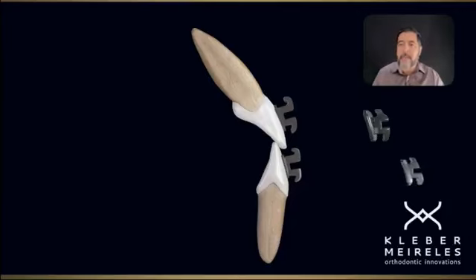brackets here. The brackets, the compensatory brackets, the class 2 or class 3 brackets, they are thought in two ways. They can be for finishing or for moving teeth in a compensatory way. Let's think about the finishing bracket, meaning I want to have a high inclination of upper anterior teeth, and I need a negative inclination, an extreme negative inclination to compensate lower teeth.